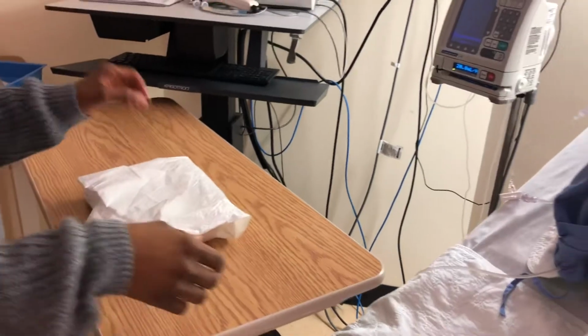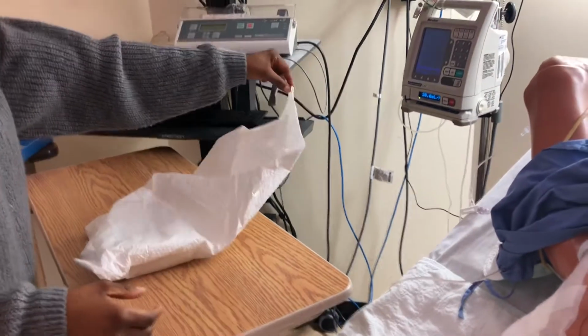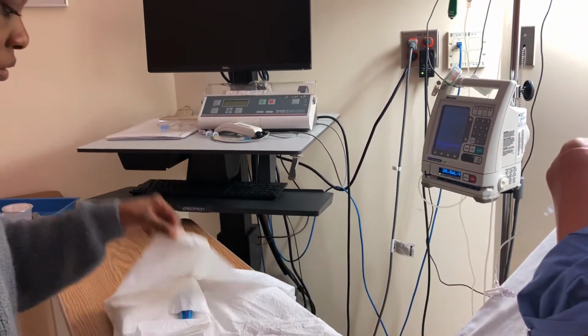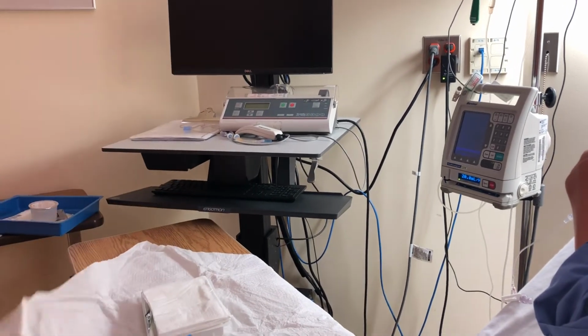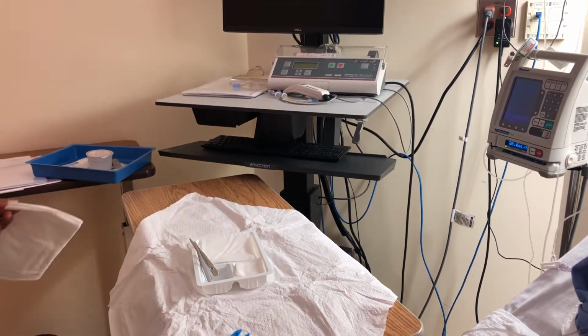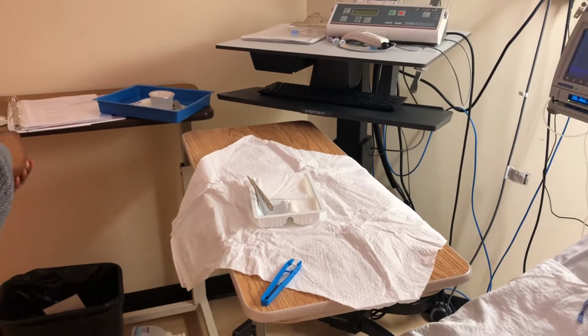So before I open, I'm just going to open all my supplies that I need. So open this, open this, open this, and then open this. So I'm just gonna take this out, pass it to myself, and leave this here. And I will do my hand hygiene.